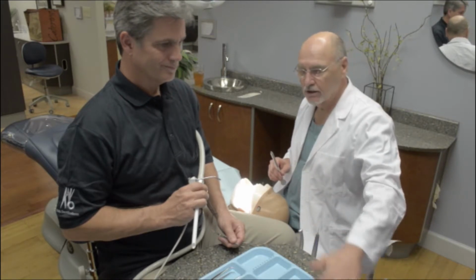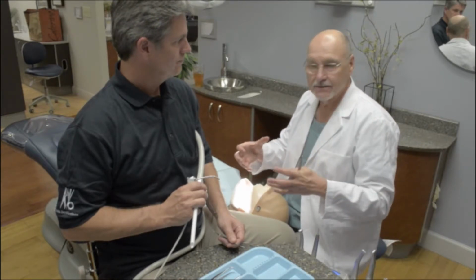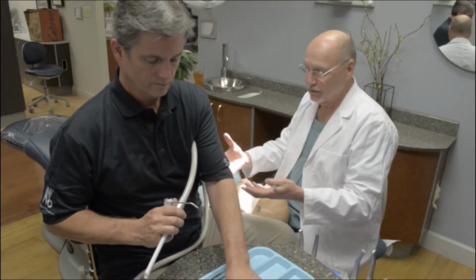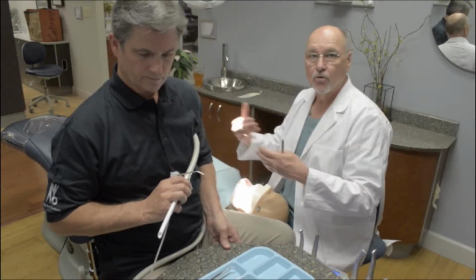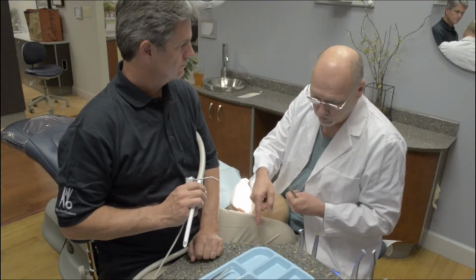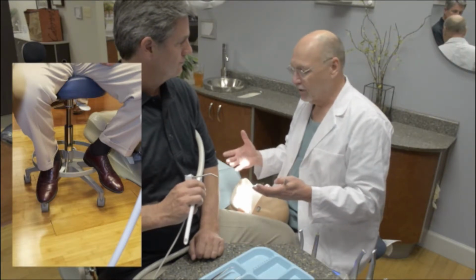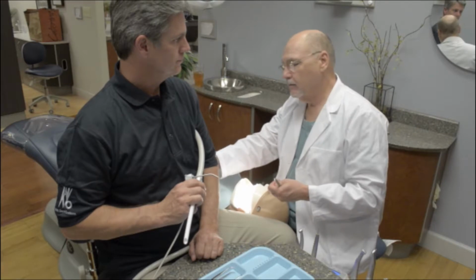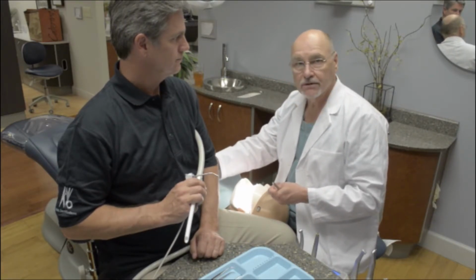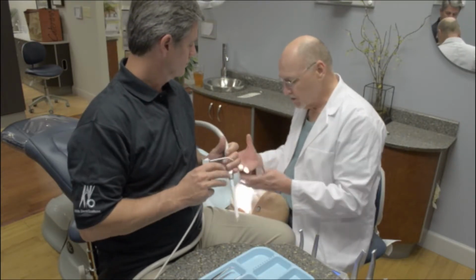Additionally, this workstation has been depressed onto the assistant's right thigh, thereby anchoring the assistant into position, because the assistant will feel some instability being so high in the air relative to the doctor. And the assistant's feet then rest on the foot ring. So they're completely anchored, and we're using the abdominal ring or rest actually as a backrest in this situation, so we're able to bring in the assistant next to the patient.